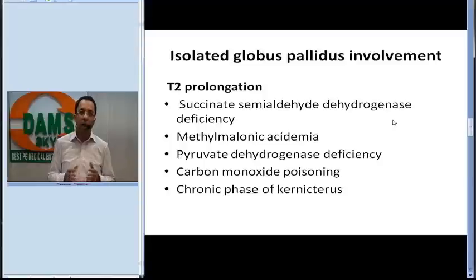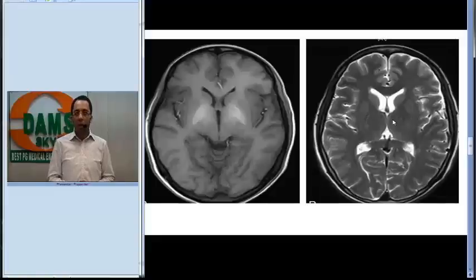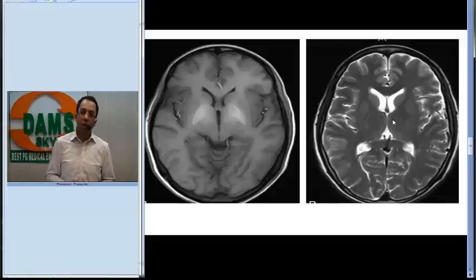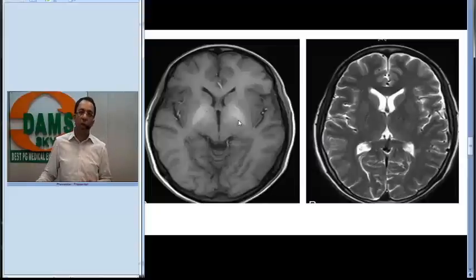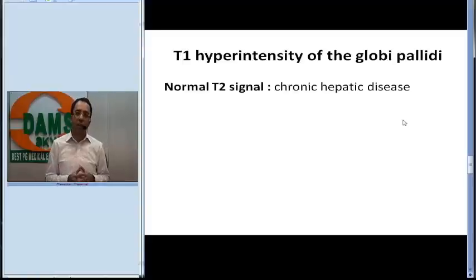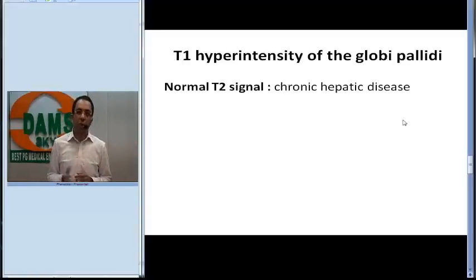Comparing with another patient: on T1-weighted and T2-weighted axial images, you can see the globus pallidus is hyperintense on T1-weighted image but normal on T2-weighted image. T1 hyperintensity of the globus pallidus with a normal T2 signal suggests disorders like chronic hepatic disease, which can lead to such an appearance on MRI.